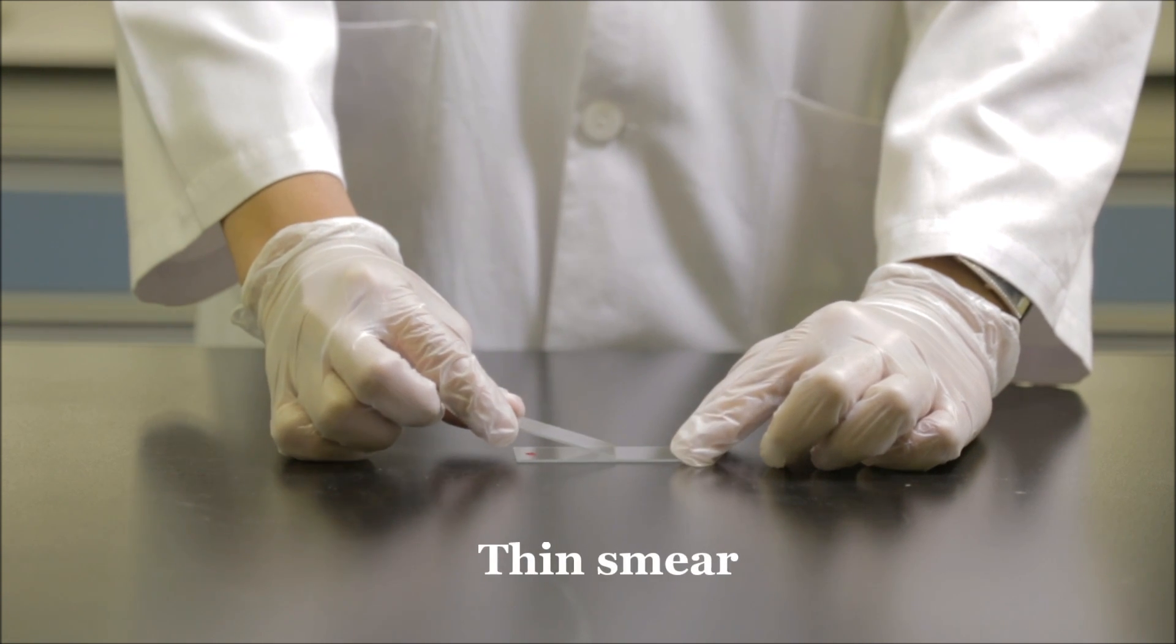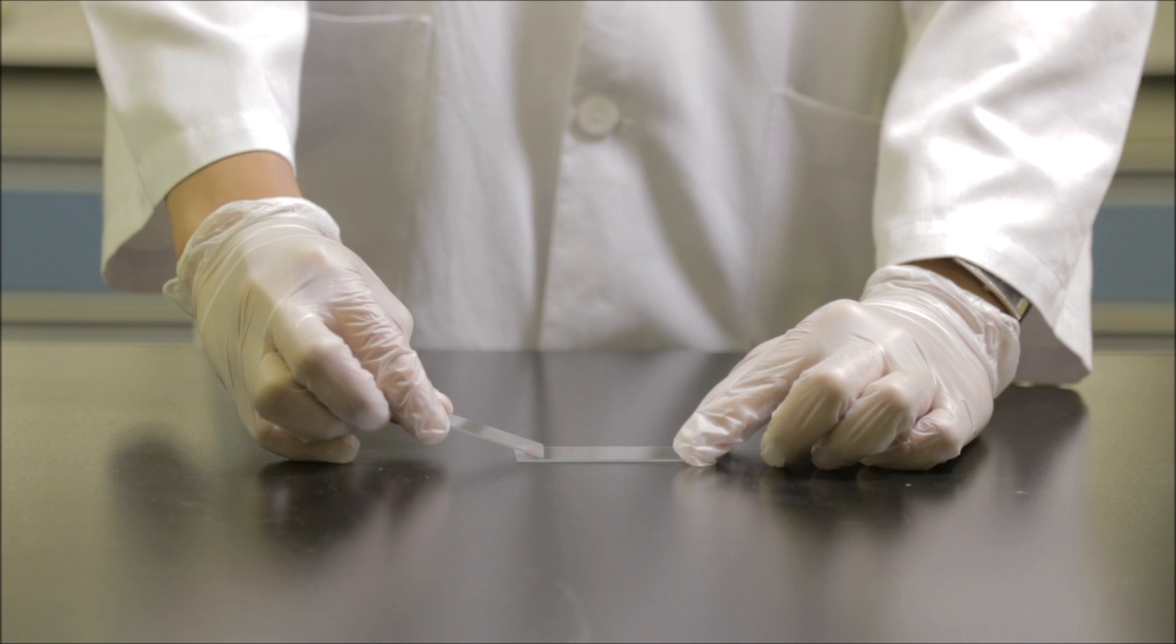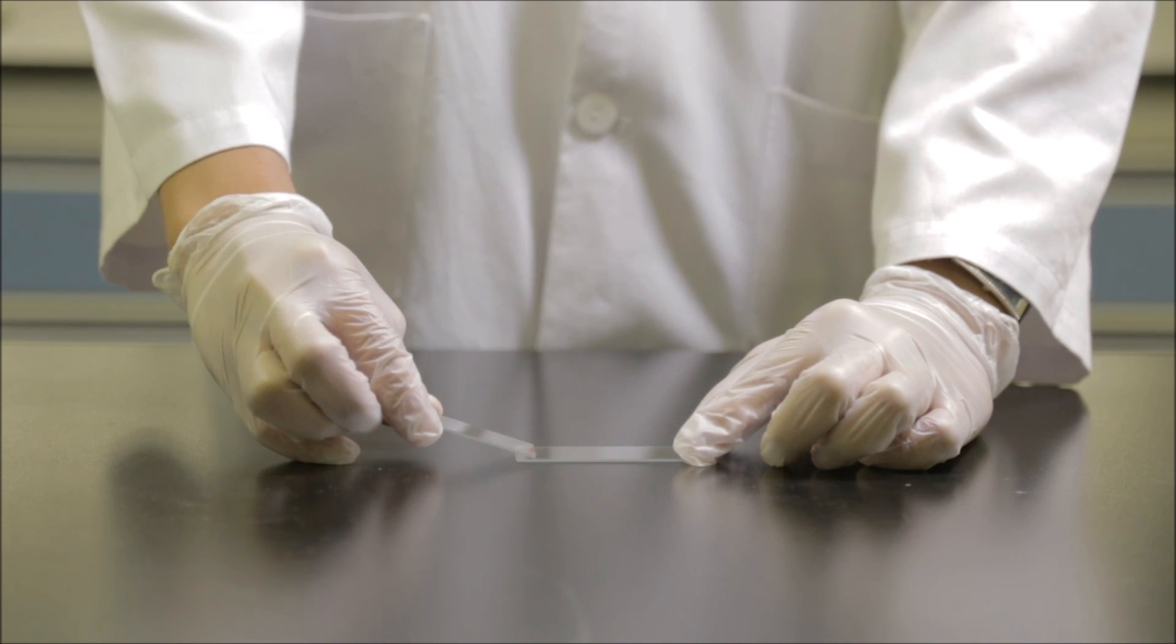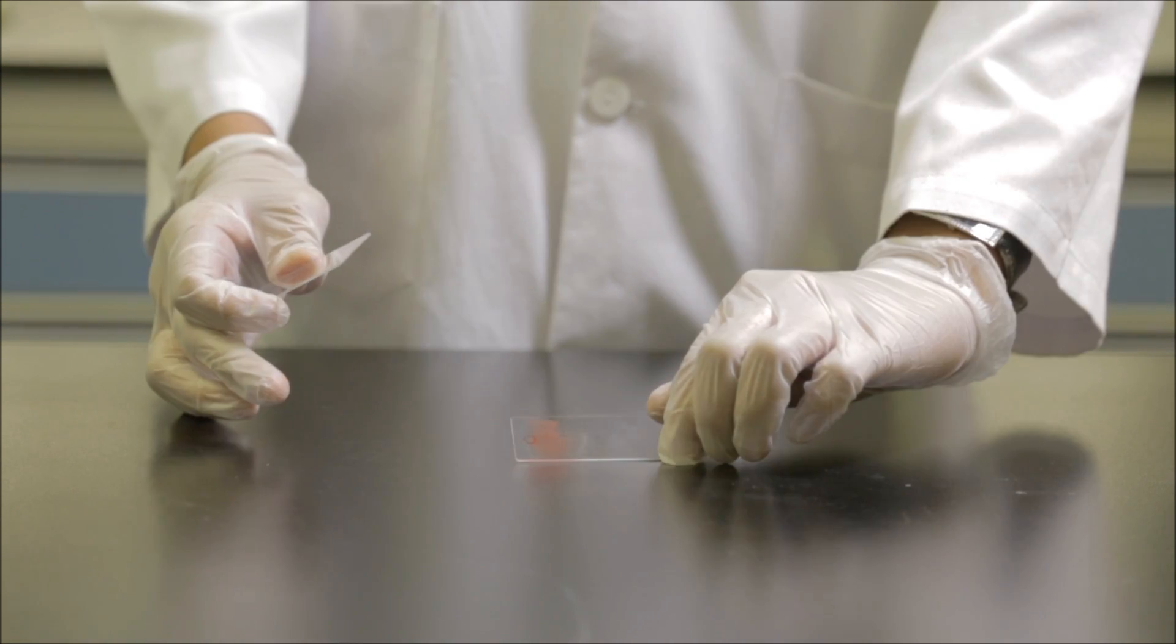In the thin smear, hold a slide at an angle of 45 degrees against the surface of the first slide. Touch the drop and let the blood spread along its edge. Push the slide forward rapidly.